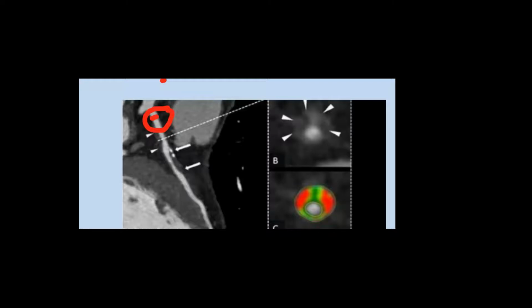Excuse me, can you hear me? Yes, I do. Yeah. You see it like I'm putting now a reference point up in the left main, and this red bar is how I measure the diameter. Let me go for the segment down.